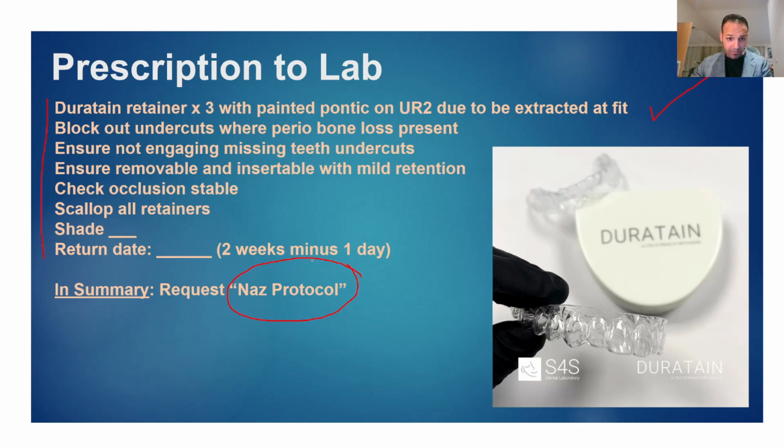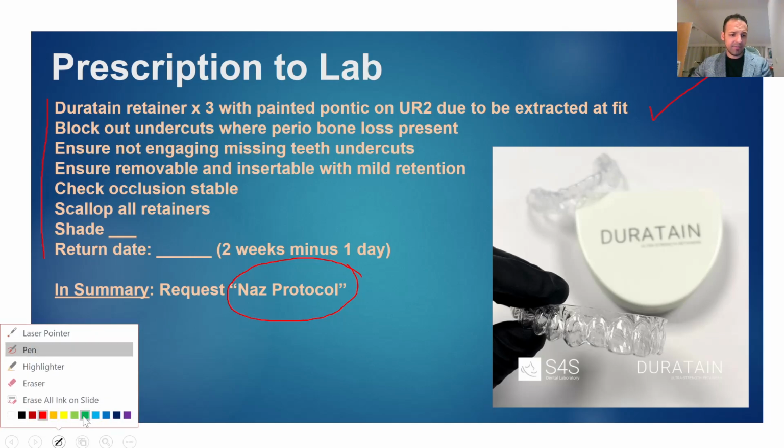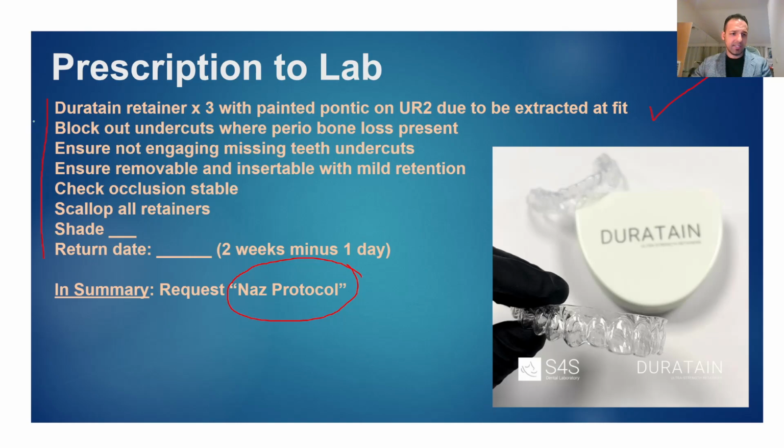The remainder you can say as per NAS protocol, and all of this stuff that I'm going to highlight in green here downwards will be part of the protocol that's already on their file. So what I've asked them to do, and I've worked with S4S a lot on this, they're a very understanding lab. They have good technicians who've been there for many years, and I've worked on this protocol to make a very good retainer.